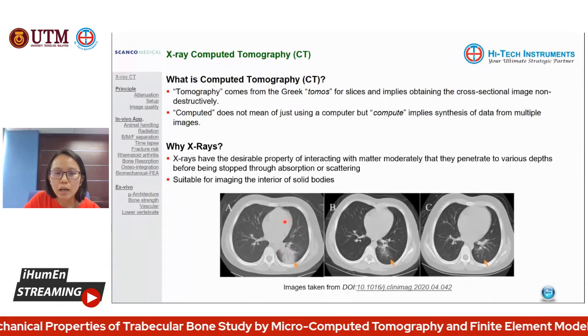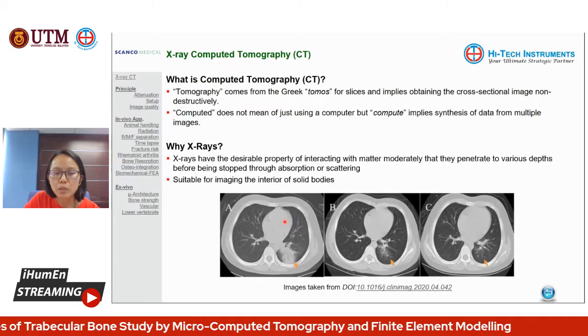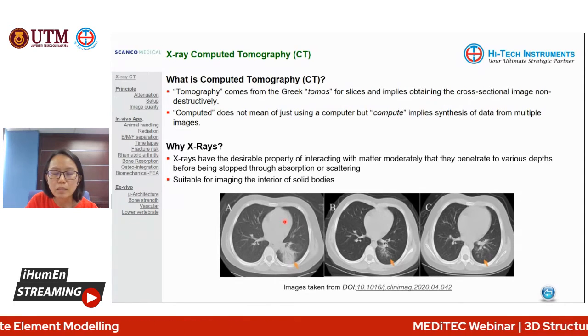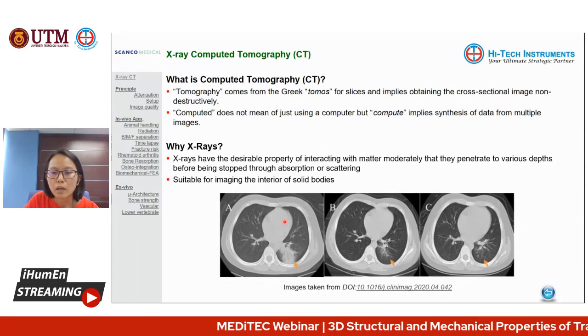This is when the CT was captured at the peak, when this 7-year-old had been diagnosed with COVID and was displaying the most severe symptoms of hardness in breathing.